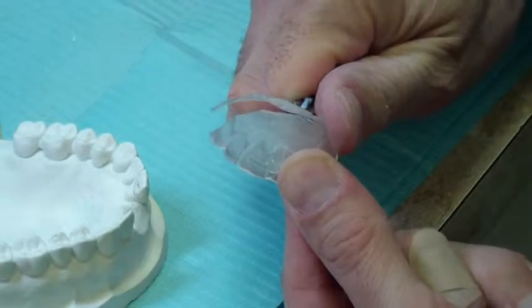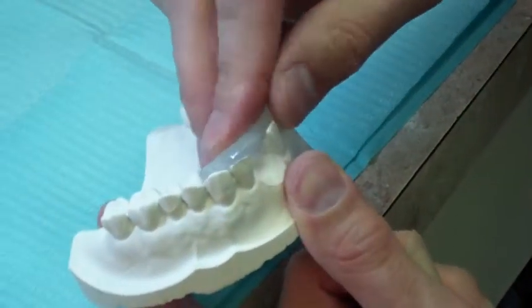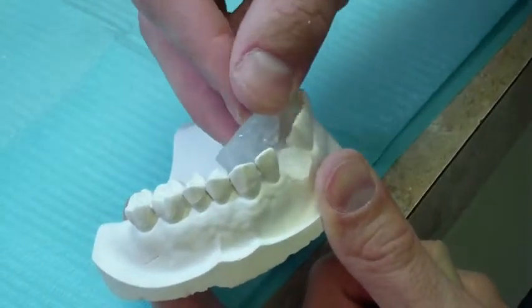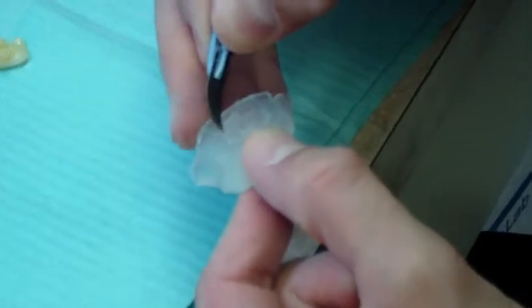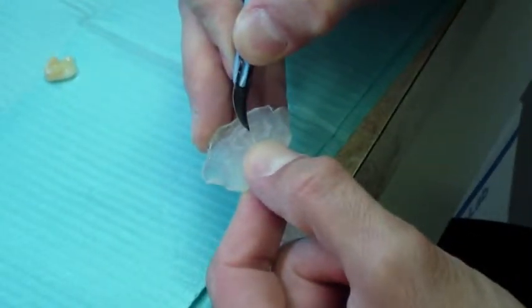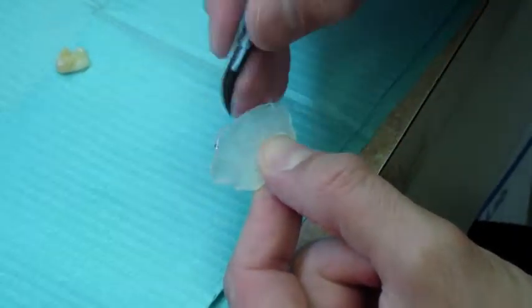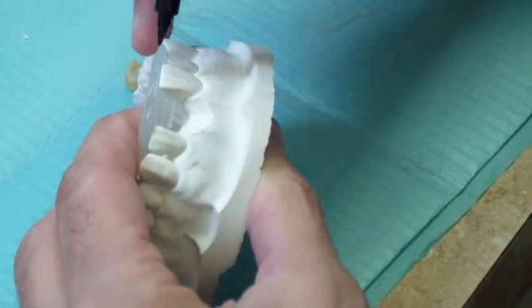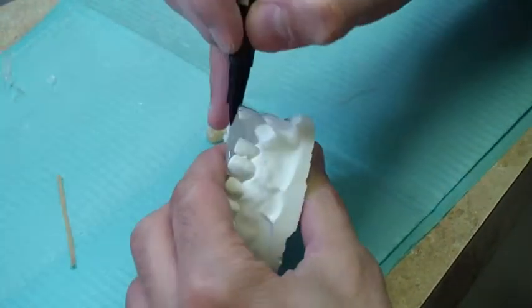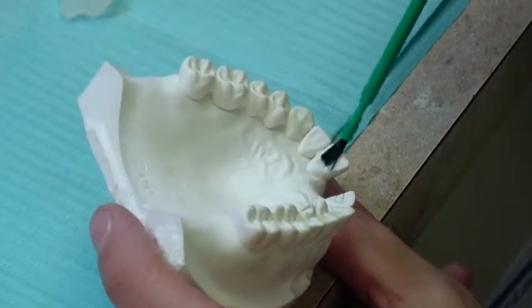Trim the index so that it can be repositioned on the model without interferences. Trim any interferences in the index in the position of the pontic, which will result in easier and more precise placement of the denture tooth in later stages. With the index in position on the model, mark the precise position of the index relative to the model. This will facilitate repositioning at later stages. Apply a separator on the working surfaces of the model and allow to dry.